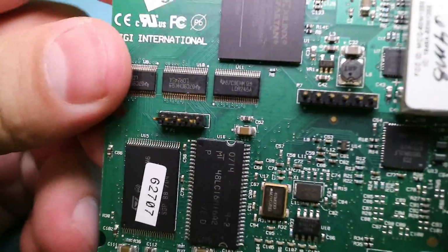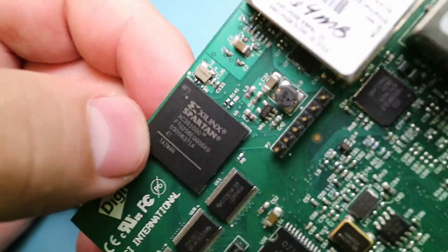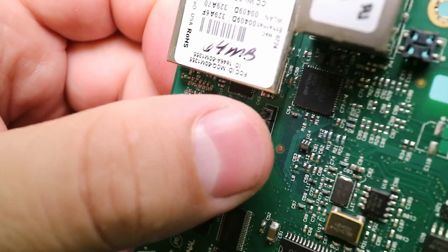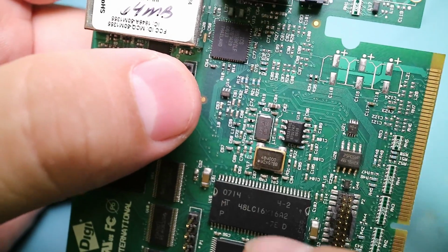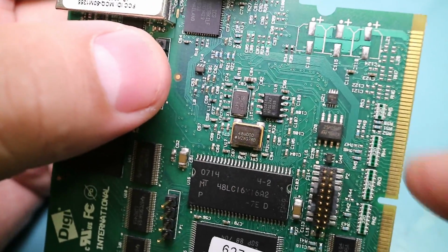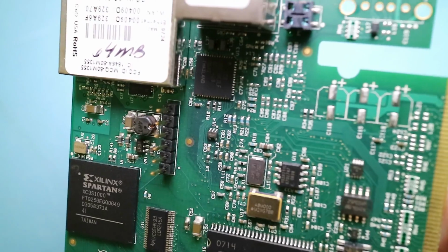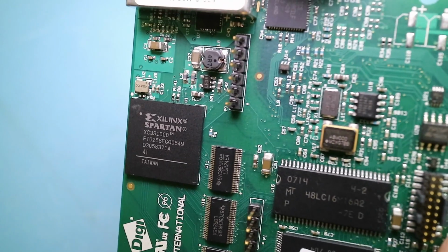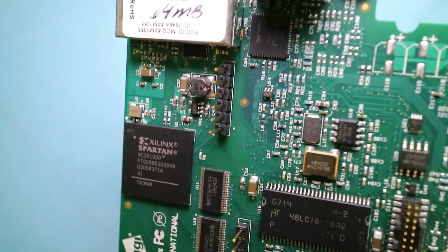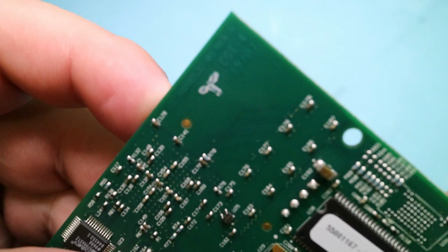Now, on the drive itself, I was able to find the operating system and stuff, and none of the apps really work. I can't really do anything with them on a modern system, and once that program boots at startup, it locks out everything, so you only get a little bit of time to play with Windows CE. I wasn't able to stop it from loading stuff, and I didn't really want to kill it by disabling the whole boot process, but it basically just loads that software, and on the drive it's just a few apps. It looks like it's all been developed with Java using the IBM WebSphere type stuff.